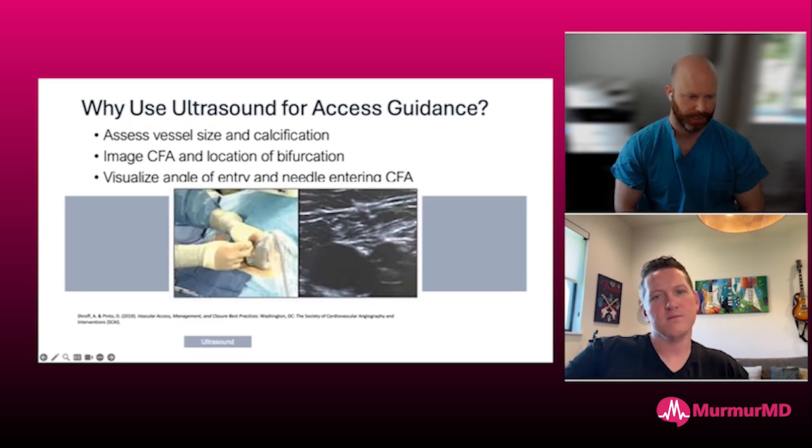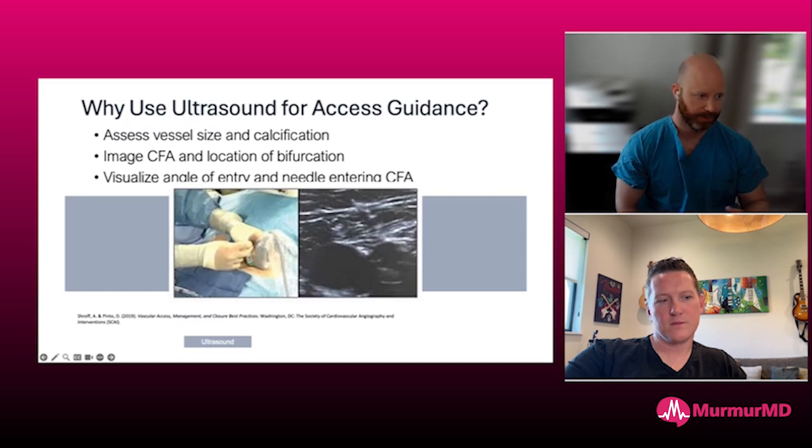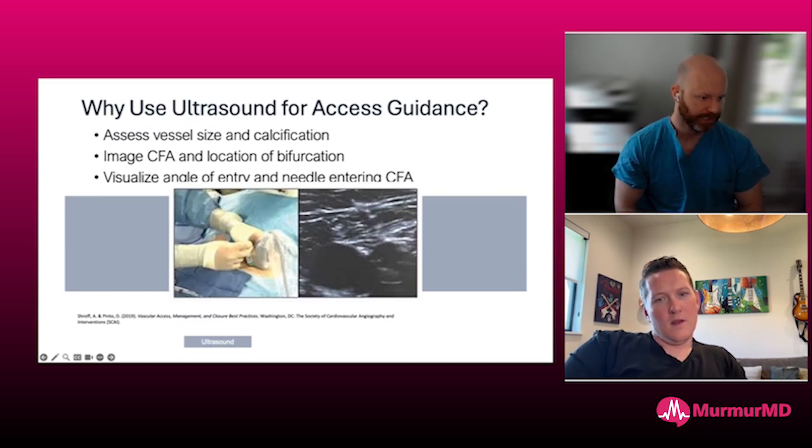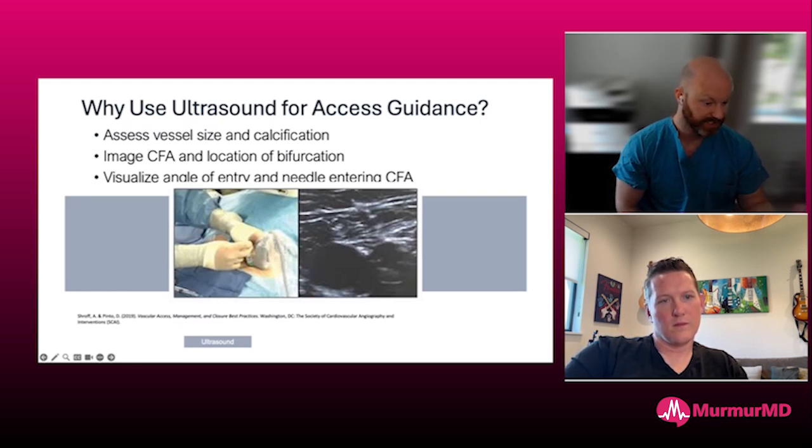I couldn't agree more. The co-registry is critical. You really need to do 2 things, right? You need to locate the landmarks. I mark those landmarks using a pen, actually, under ultrasound. Me too, I still do that. I then move the camera away and I perform ultrasound guided access using a micropuncture, as you mentioned, because we really do need to visualize the needle going into the artery, because that's really where the arteriotomy is. I then again co-register where we are fluoroscopically just to see where on the bony landmarks we feel like we've entered the vessel.